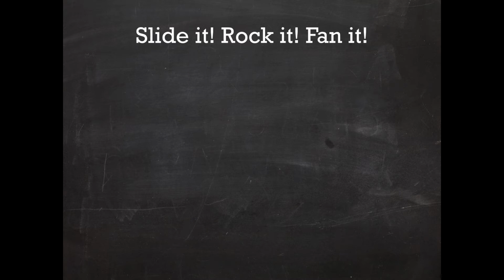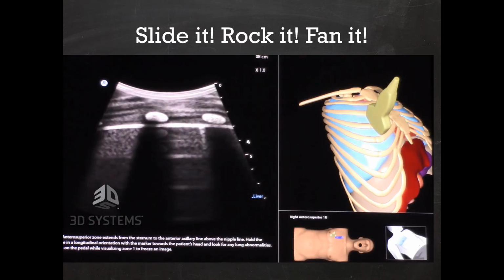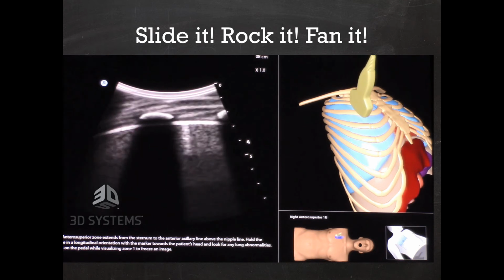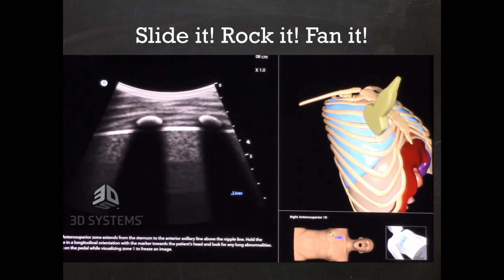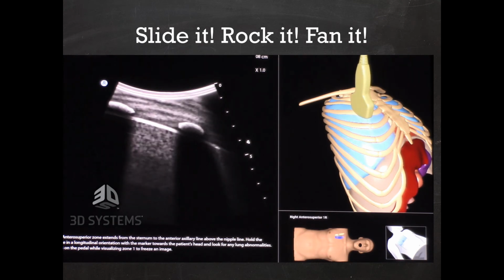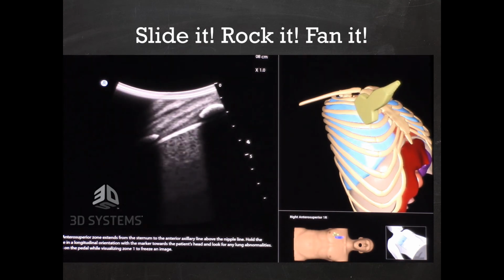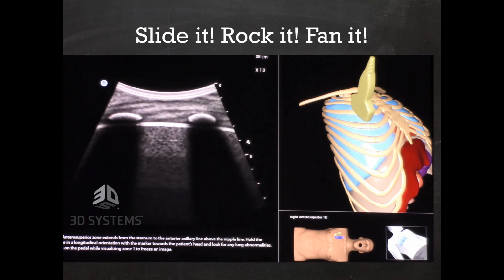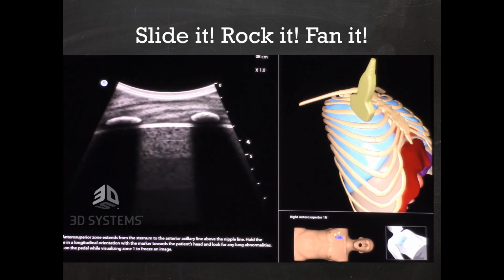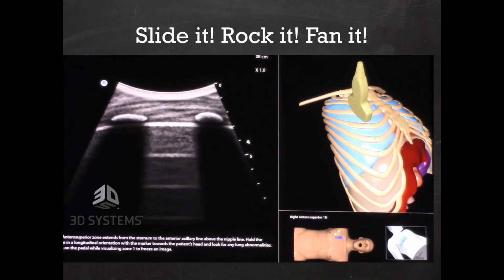As we slide the probe head to foot, we center the pleural line on the screen. When we rock the probe, you're aiming to match the head to foot curvature of the lung. So at the apex of the lungs in the anterior chest, you will note that the beam is somewhat aimed towards the patient's feet. Pay attention here. See, as you rock the probe, the pleural line flattens as the field of view swings from left to right across the screen.